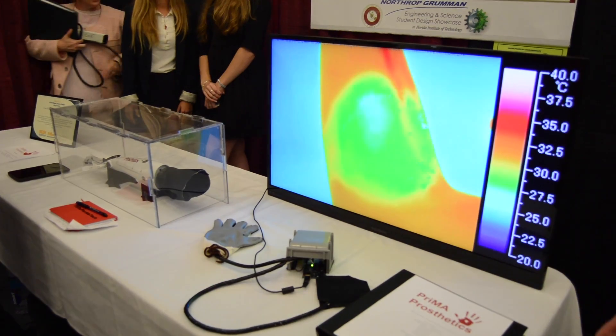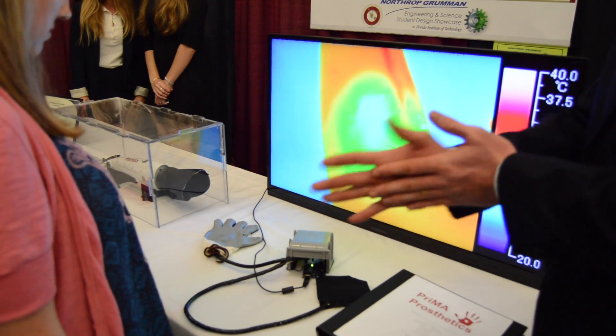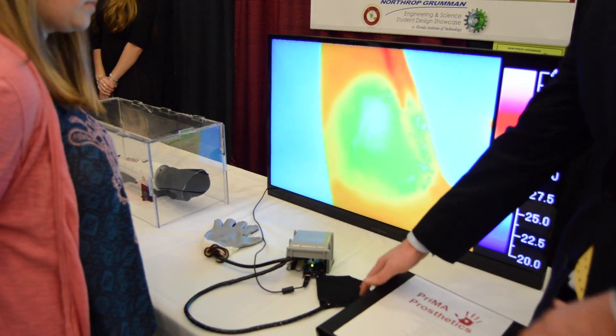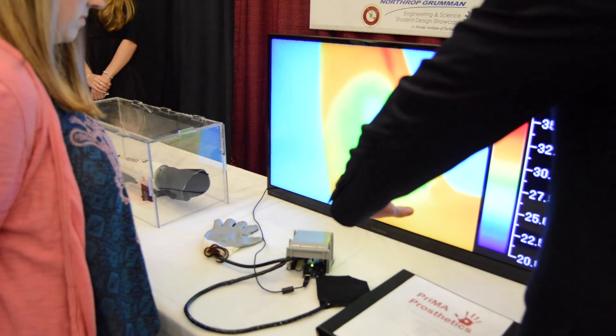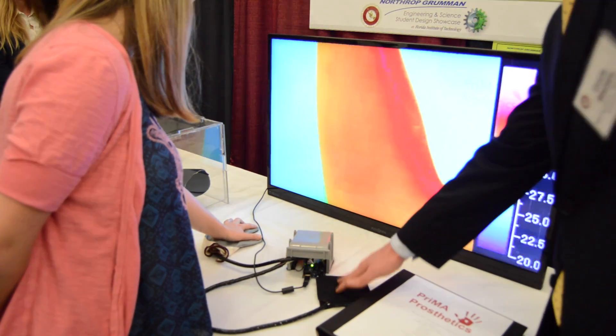Our arm is operated on EMG sensors — when a person flexes their muscles, it reads that through a processing controller and then assigns a gesture such as a pinch or a fist to each one of those flexes. The fingers are driven by DC motors which make them open and close on linear actuating devices, giving the hand up to 50 pounds of holding torque, making it one of the strongest hands on the market currently.